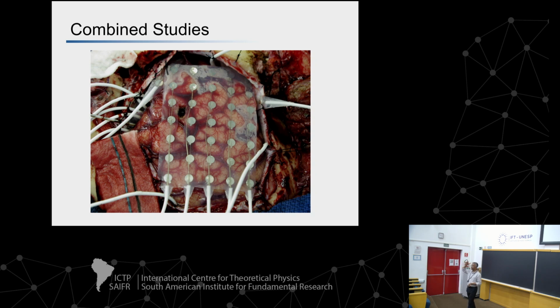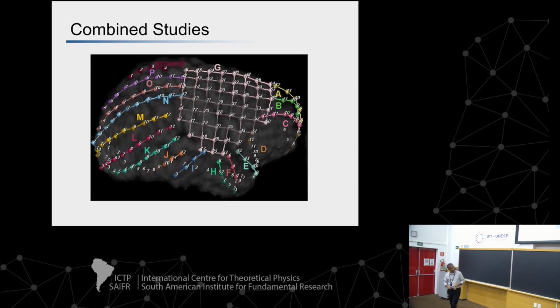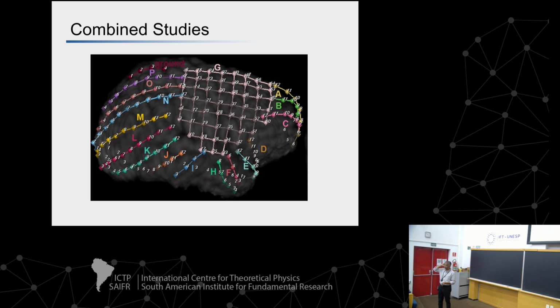So these are macro contacts placed, in this case, with a craniotomy, where the skin flap's been opened, the bone has been opened, taken out, and the electrodes have been draped over the cortex. If you do a reconstruction, this is unusual now, but you can see in this case, the surgeon wanted to cover a large amount of the cortex with literally hundreds of contacts. This is a grid that's been cut in some parts here, covering parts of the temporal lobe.